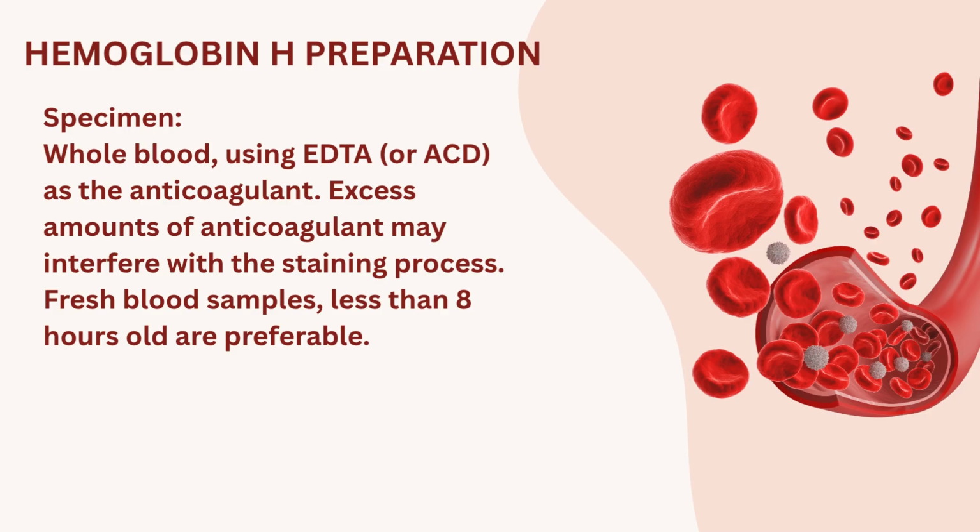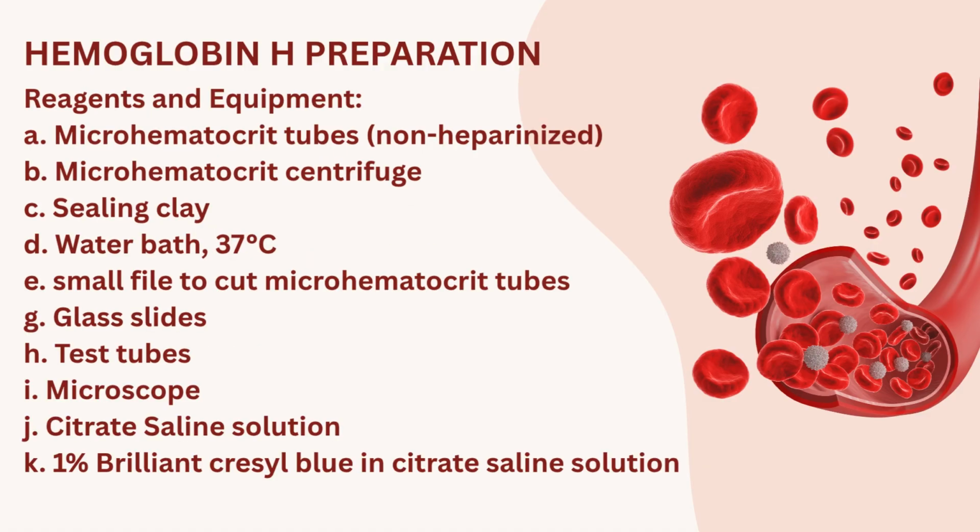So the specimen is whole blood, using EDTA or acid citrate dextrose as the anticoagulant. Excess amounts of anticoagulant may interfere with the staining process, so it should be properly collected. Fresh blood samples should be used, less than 8 hours old. Reagents and equipment.